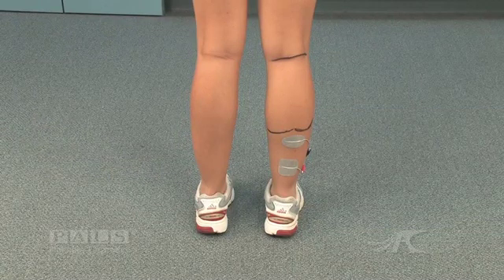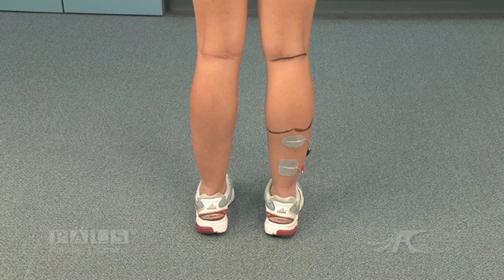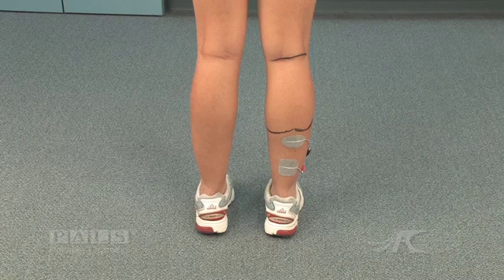The two heads of the gastroc are marked. Using an asymmetric waveform, the negative electrode is placed just below the heads of the gastroc. The positive electrode is placed above the Achilles tendon. This allows isolated activation of the soleus.